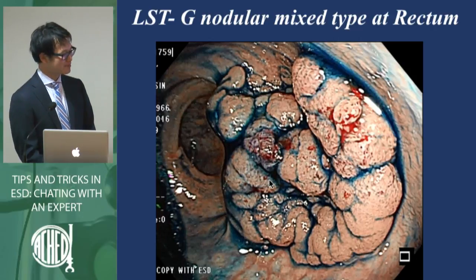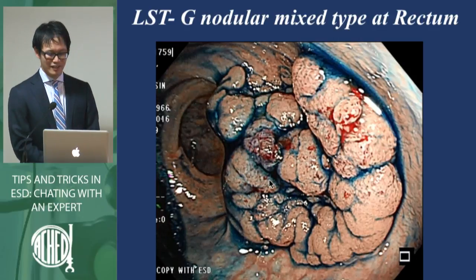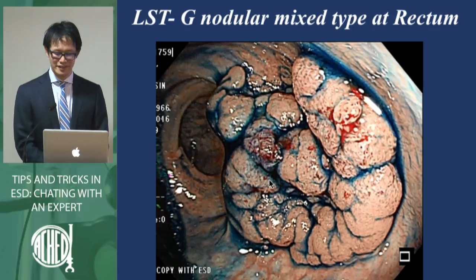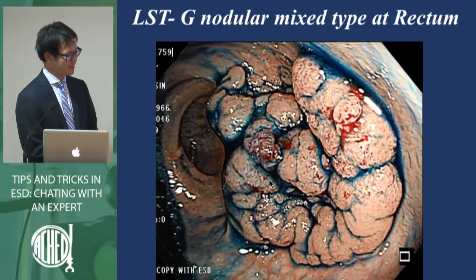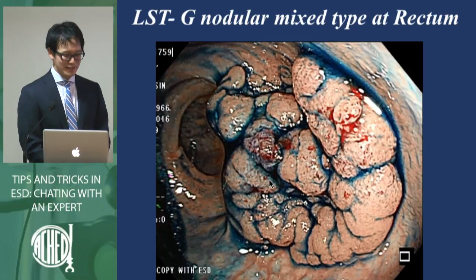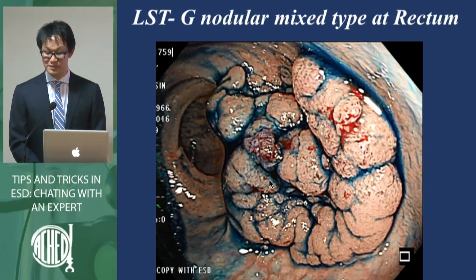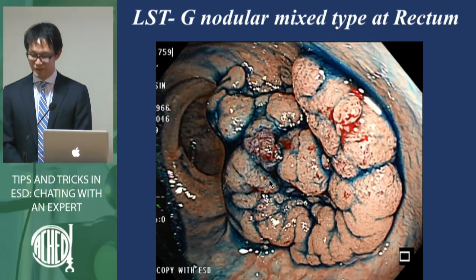So it's a very difficult question because Japanese have the skill of ESD. So we usually resect by ESD procedures, but for this lesion we checked the magnified endoscopy, there is no type 5 pit patterns. We are allowed to resect by EMR piecemeal procedures. Yes. Dr. Ishida, would you mind if I take just 15 seconds to talk in Spanish?